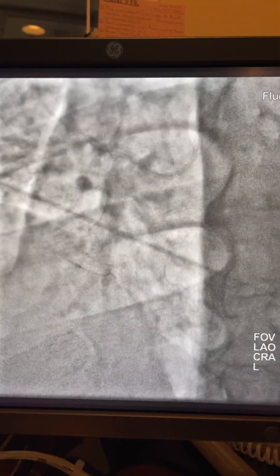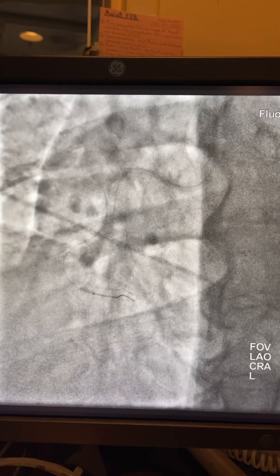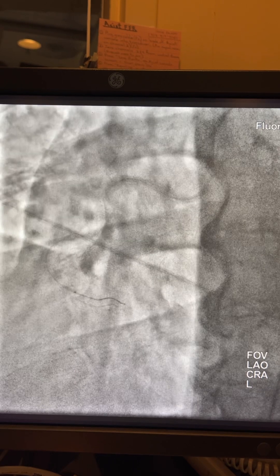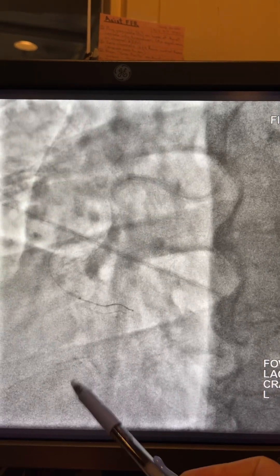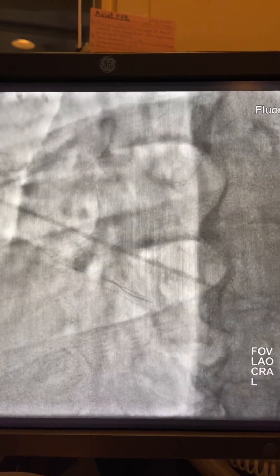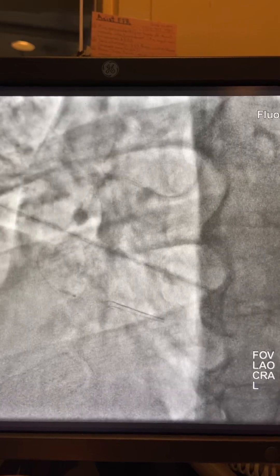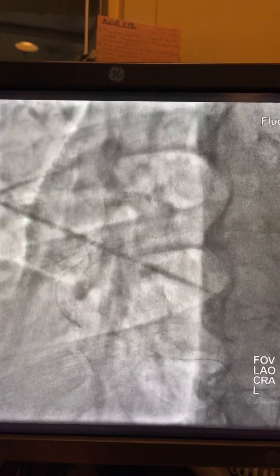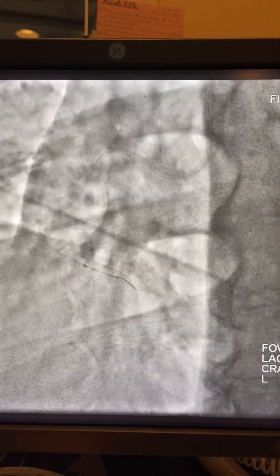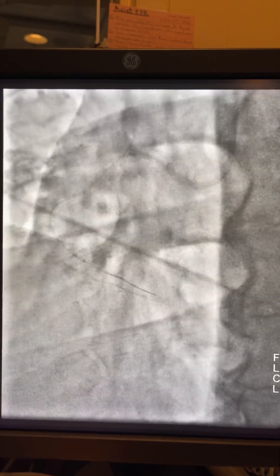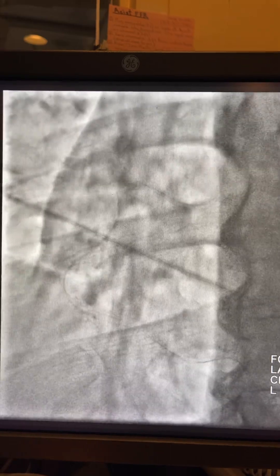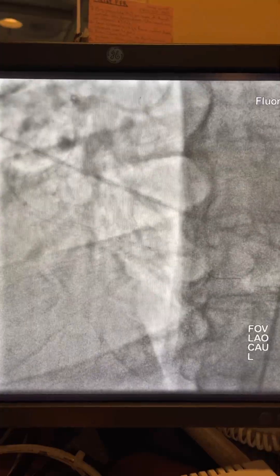So the trick here: you inflate the balloon at low pressure, and then while the balloon is inflated, you advance the wire. I'll show it again — the inflated balloon gives support to the wire, and then you advance it forward.